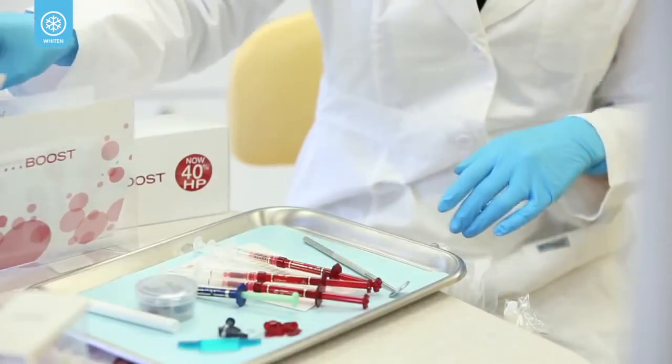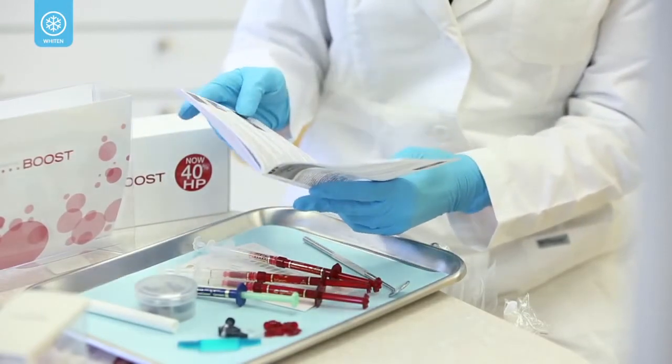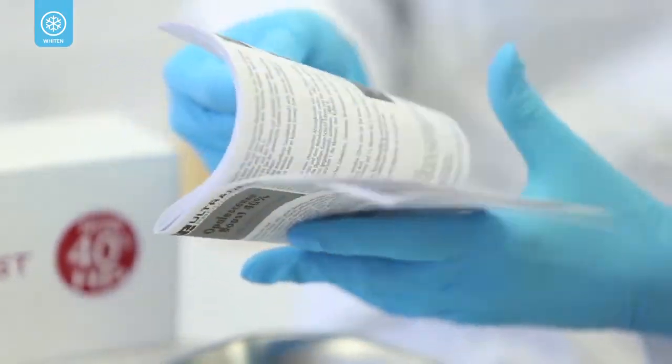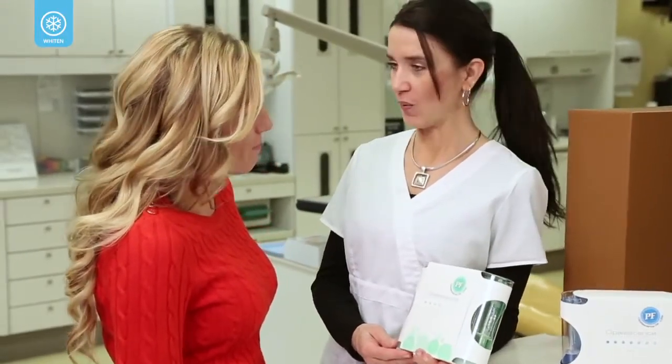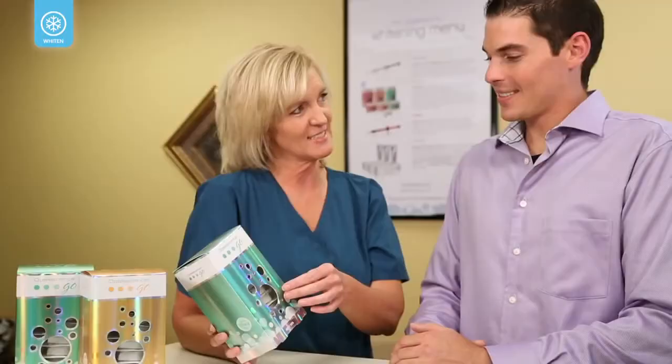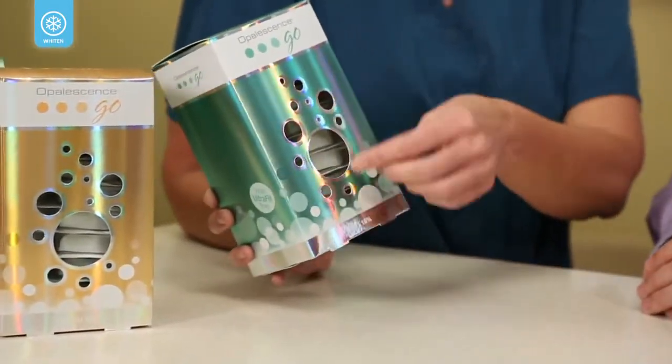Be certain to read the product instructions, warnings, and information for the patient contained in the package, and advise the patient accordingly. Many clinicians find patients enjoy having a take-home option to follow up their in-office treatment and continue the whitening process. The patient should wait 24 to 48 hours before beginning an at-home whitening treatment.